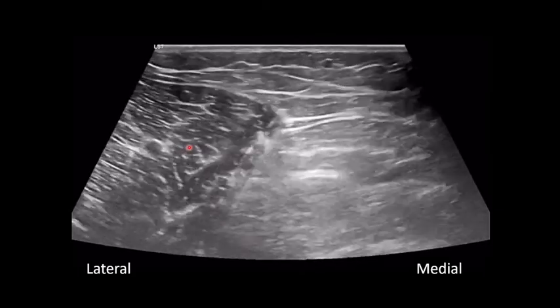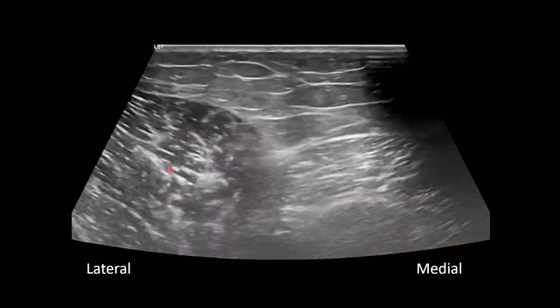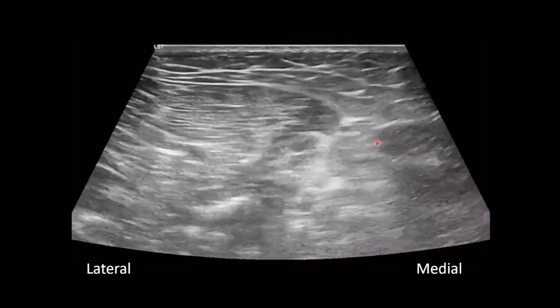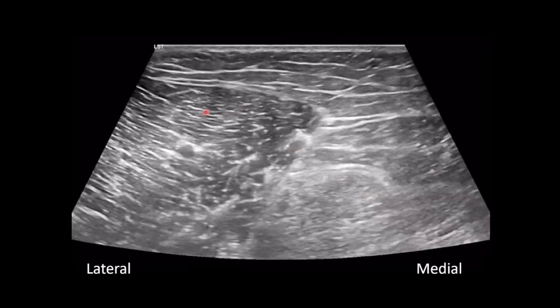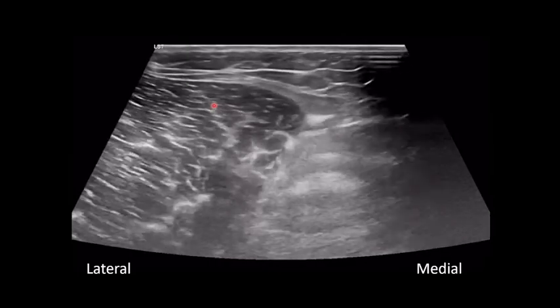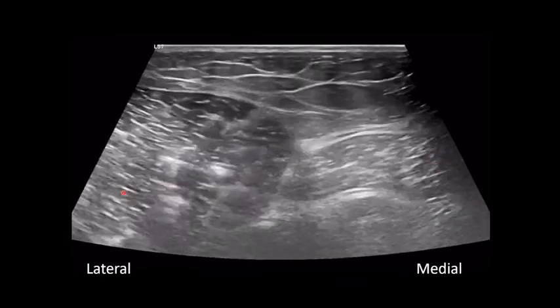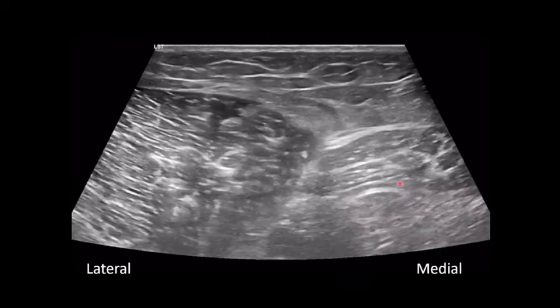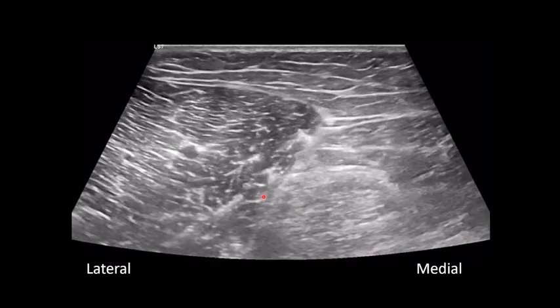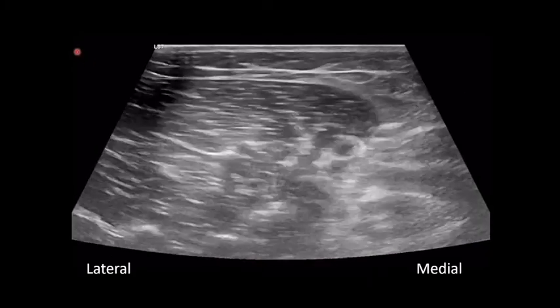As you scan through the distal portion of the thigh in the medial aspect, you'll see the prominent muscle belly of the vastus medialis. The fascial plane between this muscle and the sartorius, which is seen medially, should contain the distal branch of the femoral artery as well as the saphenous nerve. You see vastus medialis here, sartorius here — looking in this area for the fascial plane, we eventually see the nerve-vascular bundle. The artery can be seen pulsating, and the nerve is just medial to that.